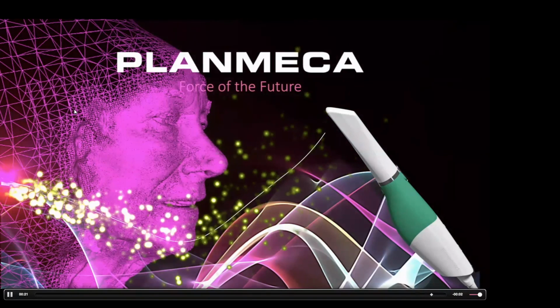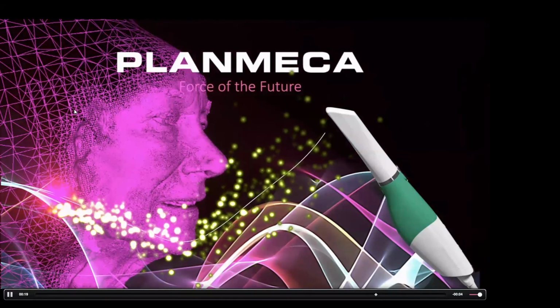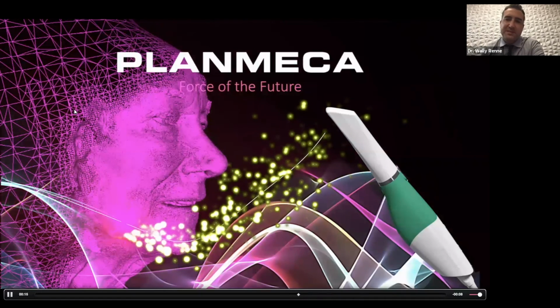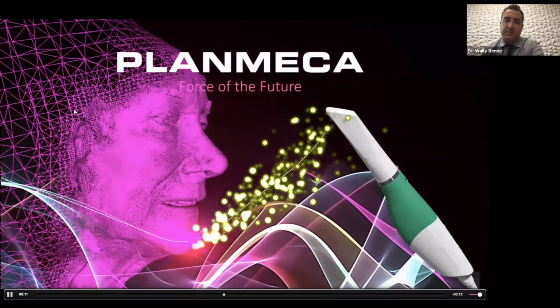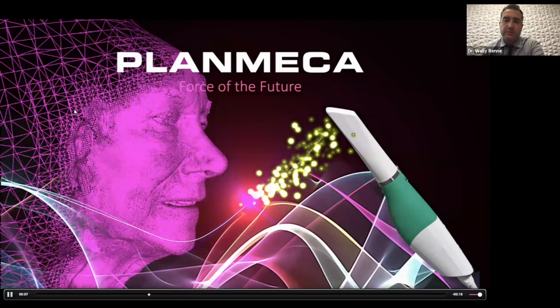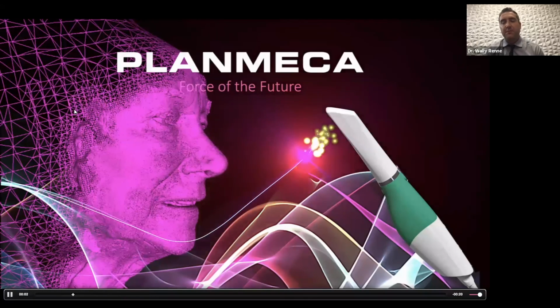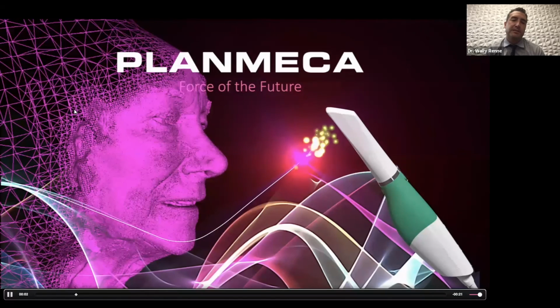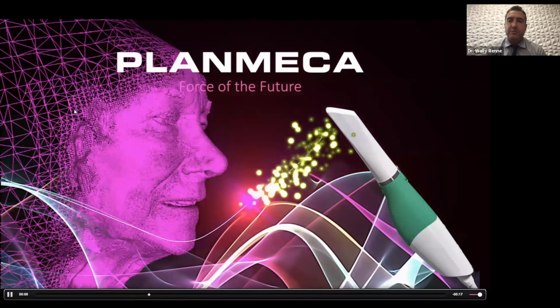Thanks so much for being here today and giving this presentation on smile design. Thank you guys for allowing me to give this presentation. I think this is a topic that's just super exciting because we used to have to do a lot of these things manually using digital calipers and have the patient sit in the chair for a long time and measure their face and their teeth and everything like that. And so the ability to use digital smile design is an integral part of my practice.